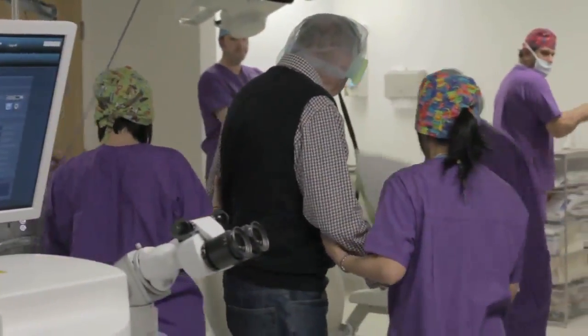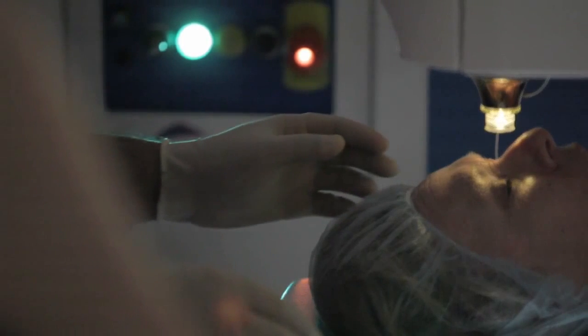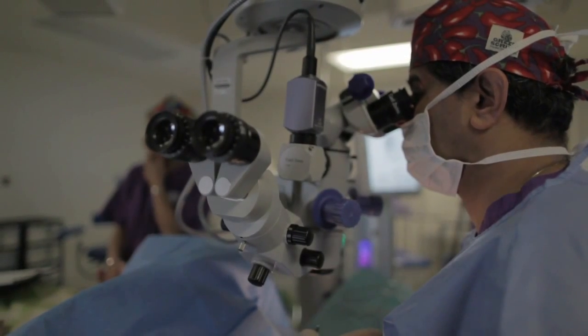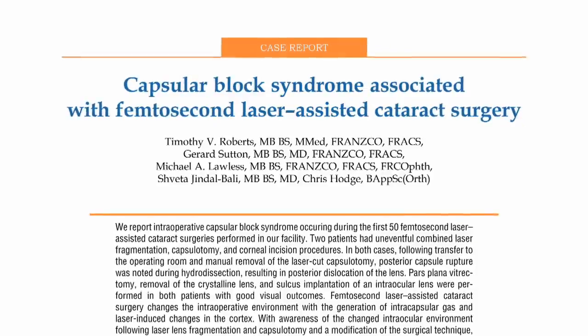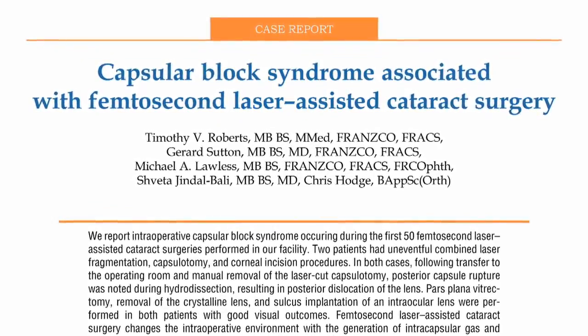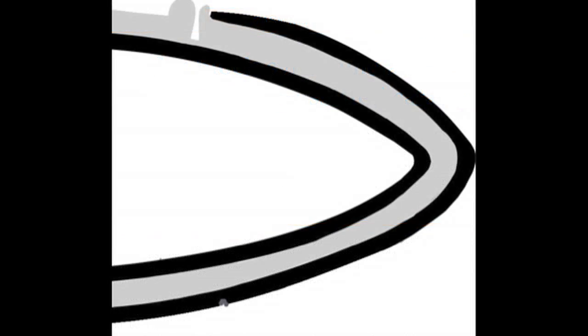Use of the femtosecond laser requires some changes in technique from conventional cataract surgery. Conventional hydrodissection can lead to capsular distension and capsule block, with posterior capsular rupture and loss of the lens, as reported by Roberts and colleagues in Australia. Although the cause has been attributed to gas accumulation and pneumodissection along with fluid entrapment, we believe that fusion between the denatured cortex and the anterior capsule edge produces a circumferential seal that does not allow fluid to escape.